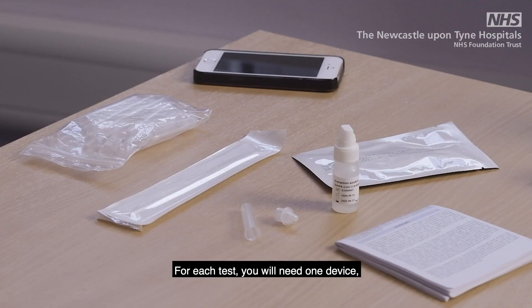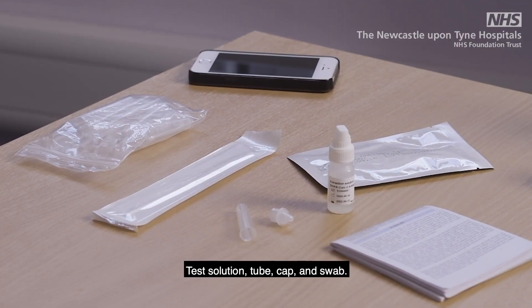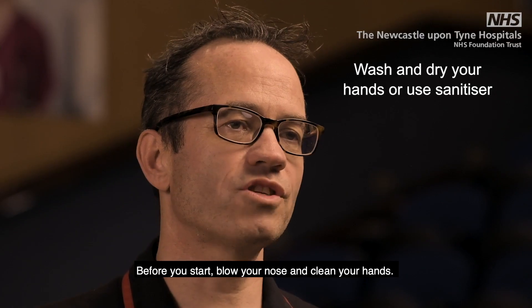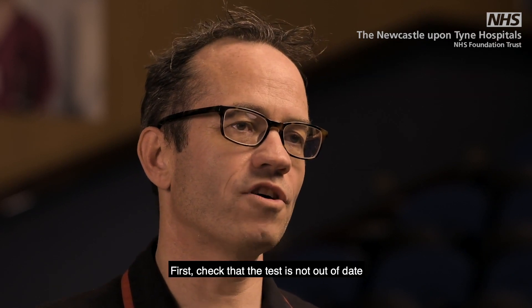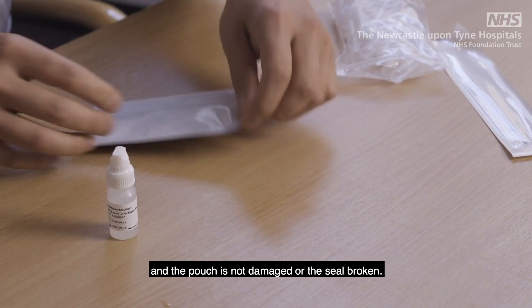For each test you will need one device, test solution, tube, cap and swab. Make sure you also have the instructions to hand. Before you start, blow your nose and clean your hands. First check that the test is not out of date and the pouch is not damaged or the seal broken.